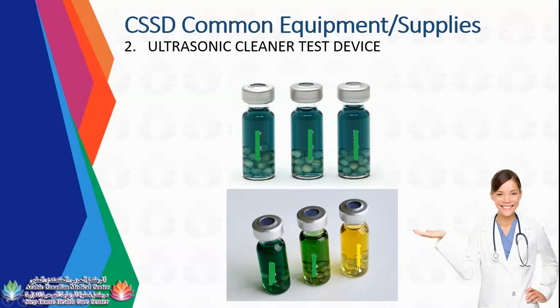If it is still green or dark green, it means your sound waves is not working well, so it cannot remove any debris in the instruments. If it is in the middle, what you can see in the middle, it can clean, but not totally. So the test device needs to be changed from blue-green to yellow.